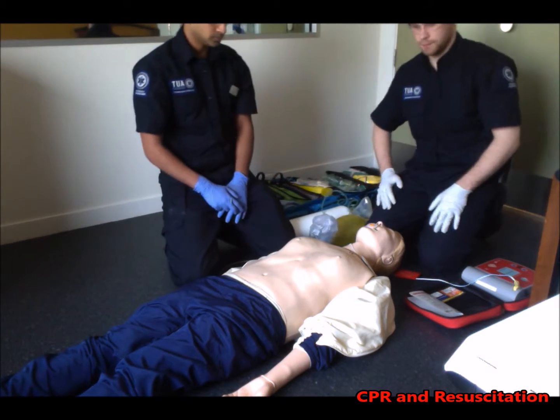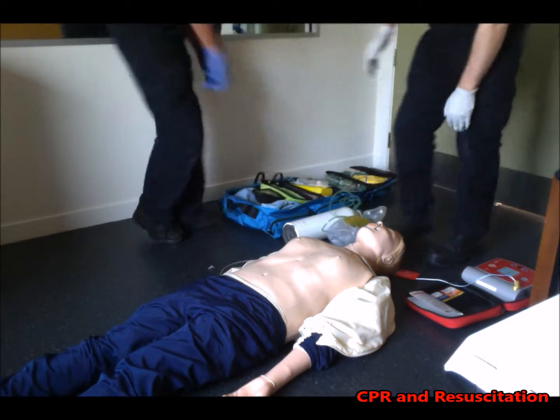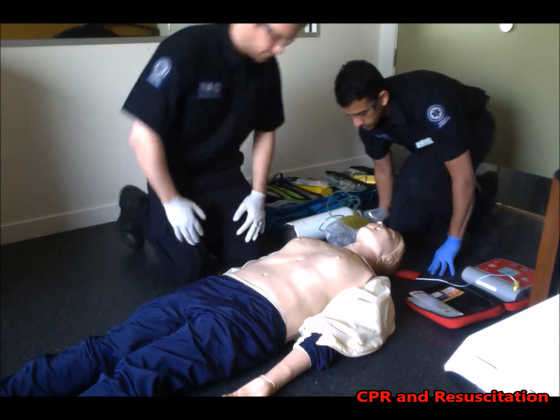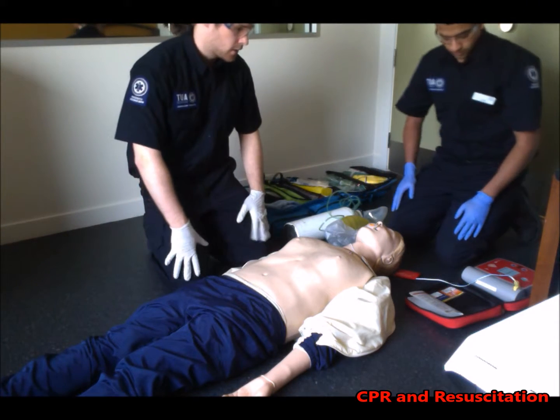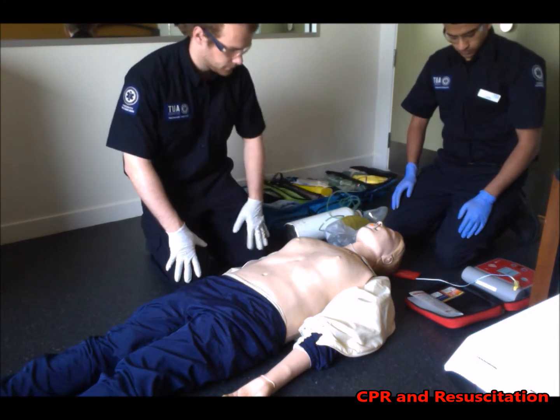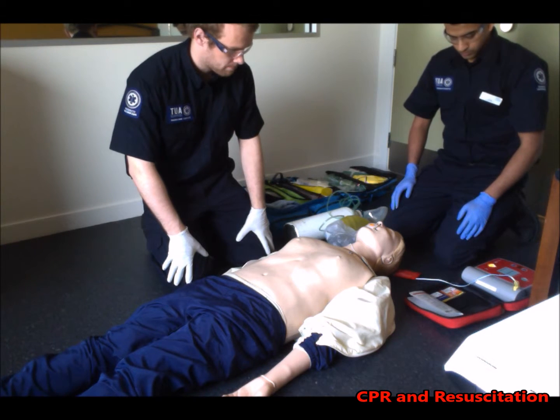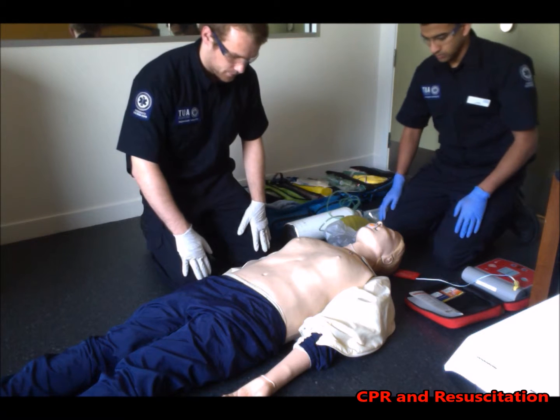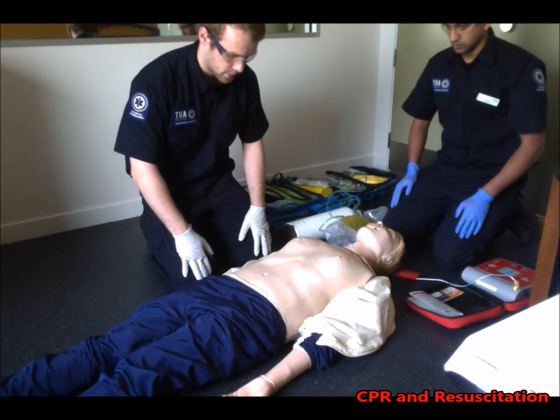Analyzing heart rhythm. So now I'm going to switch positions. Stay clear of patient. Shock advised. So it's going to charge. Deliver shock now. Press the orange button. Shock delivered. Paused. Start CPR.